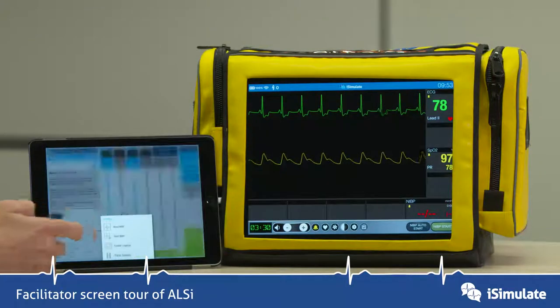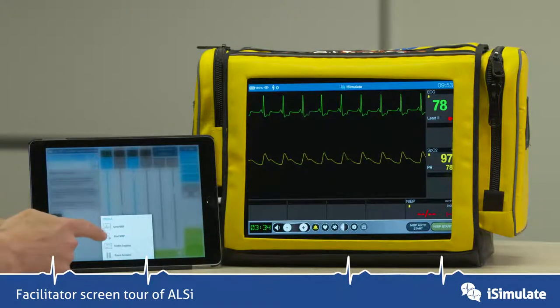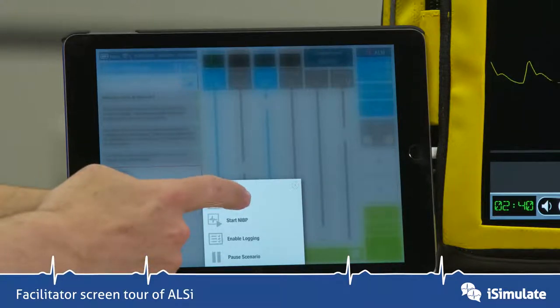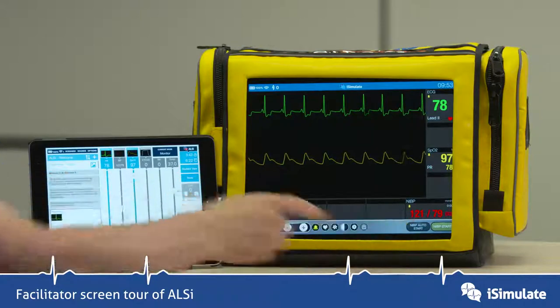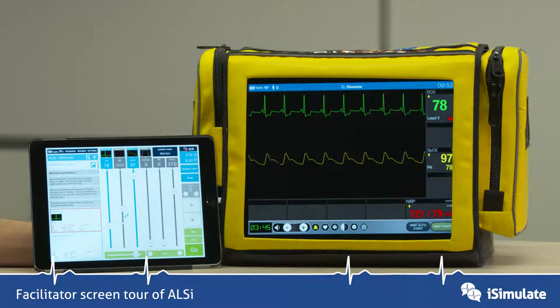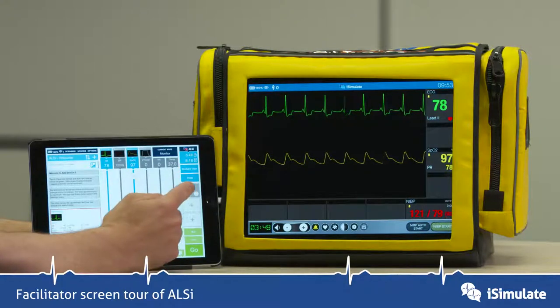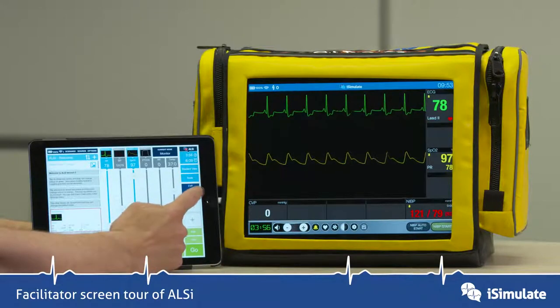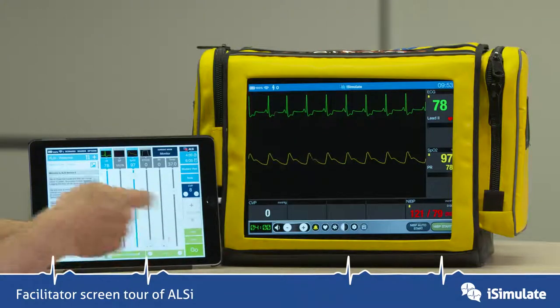There's a tools menu which has four quite useful functions: send BP, start NIBP, enable logging, and pause scenario. I'm going to send NIBP — you tap on that and you can send the blood pressure over onto the student screen. There are also custom numerics, and by activating that you will see that the CVP number has appeared. You can alter those numbers by changing them and pressing go.